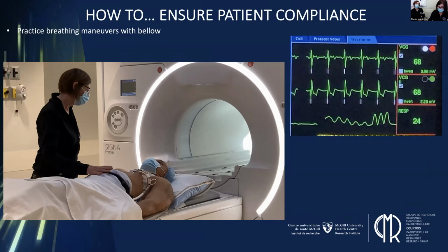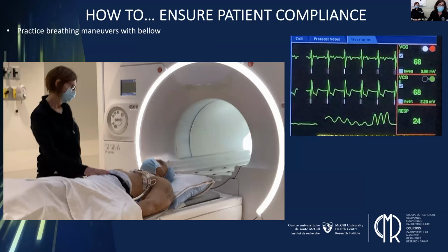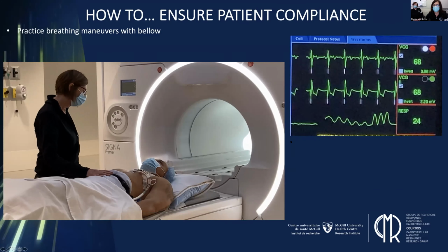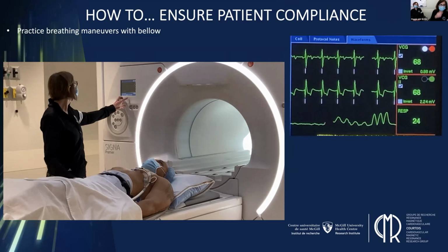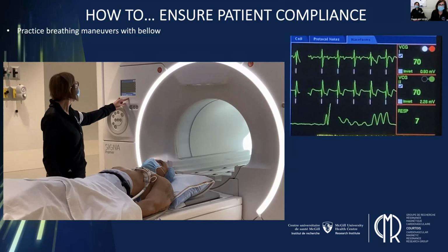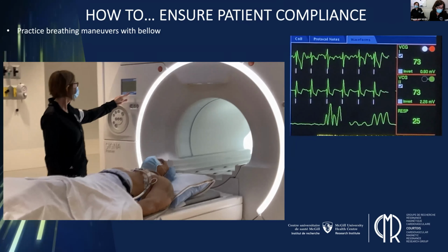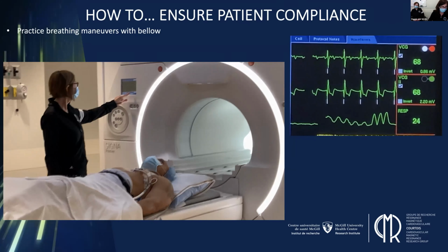Okay, sir. Now let's practice your breathing maneuvers. Sorry. Let me do that again. Okay, sir. Now let's practice your breathing maneuvers. So just follow the beat, please. That's perfect. So we verify their breathing pattern by using the in-room display monitor that you see in the upper right-hand corner of your page.